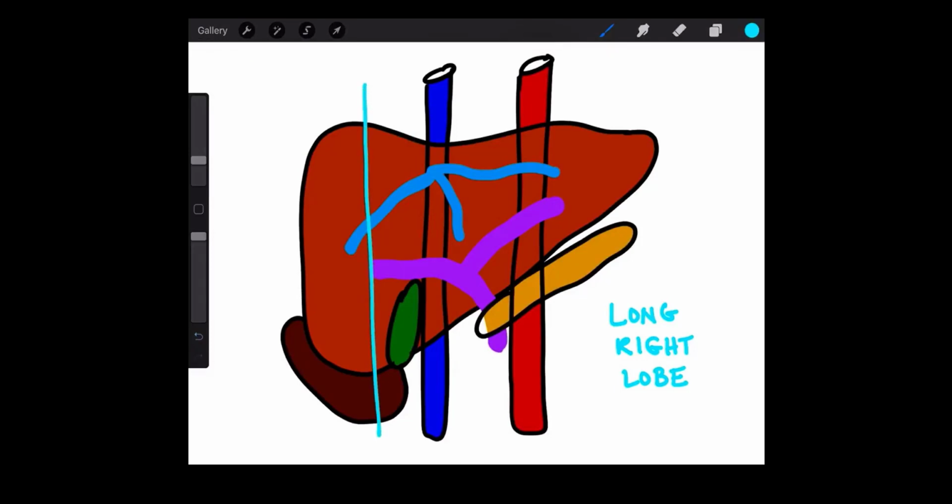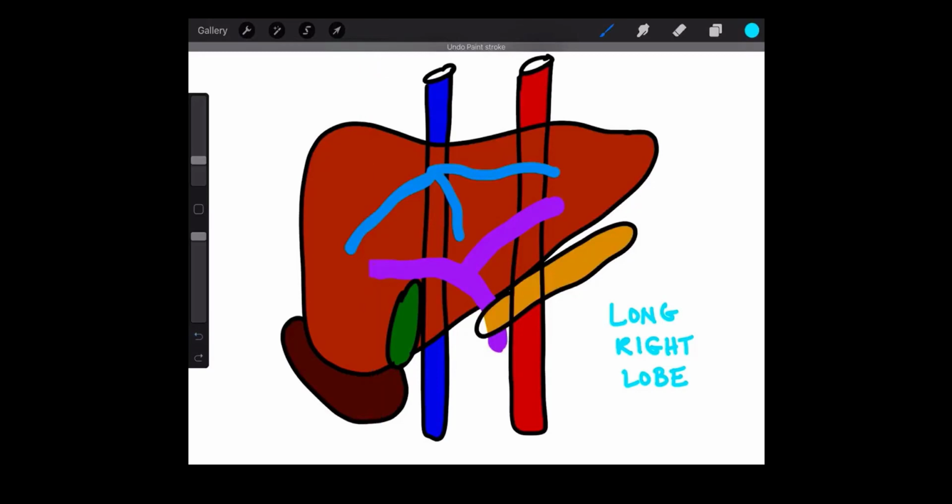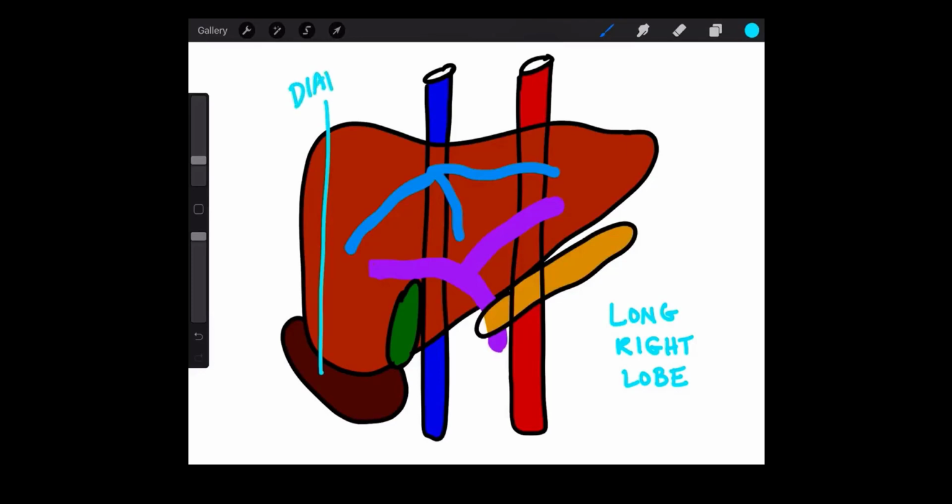We'll then move more towards the patient's right, imaging the area of the right kidney and the liver at their interface so we can compare the parenchyma of the two. And then lastly, in this long field, we will slide all the way to the patient's lateral right side to catch an image towards the diaphragm. Turning our transducer into transverse then, we are going to start working on the transverse right lobe, just like we did on the left lobe, working superior to inferior.